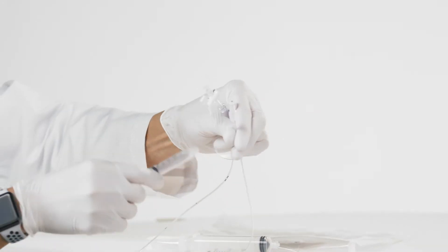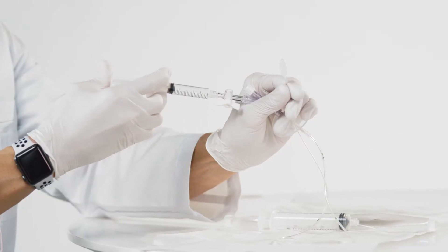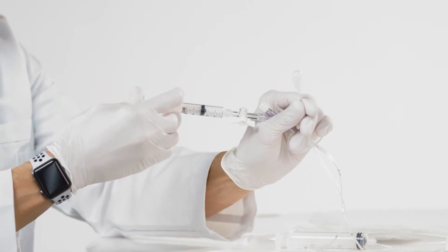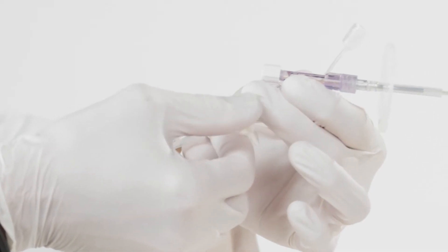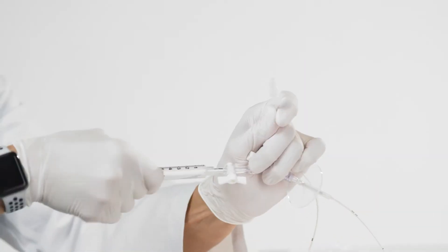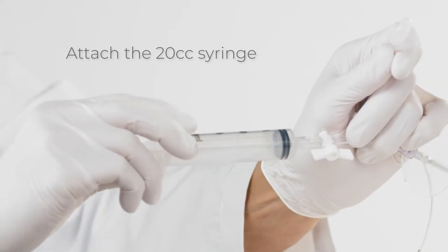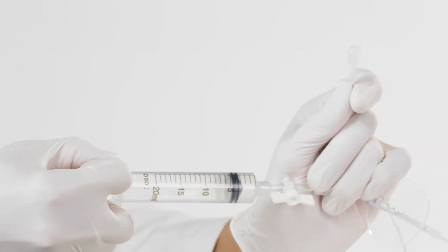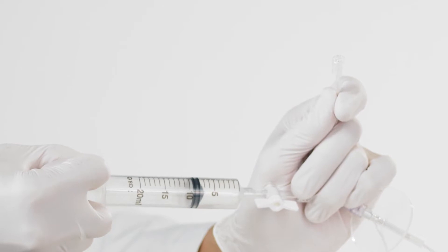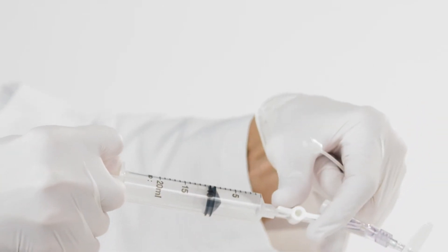To test balloon integrity, attach the 5 cc syringe to the lower fitting. With the stopcock open, inflate with 5.6 cc's of air and close the stopcock. Replace the small syringe with the 20 cc syringe. Open the stopcock and apply vacuum by pulling the syringe plunger to 10 to 15 cc. This will deflate and invert the balloon into the capsule.